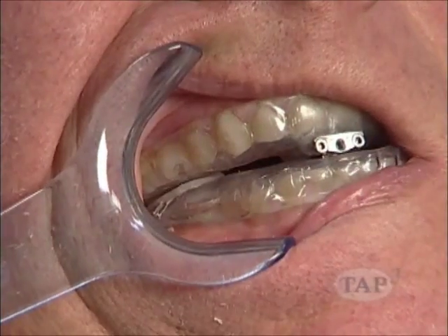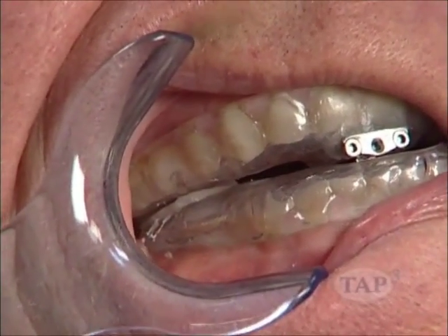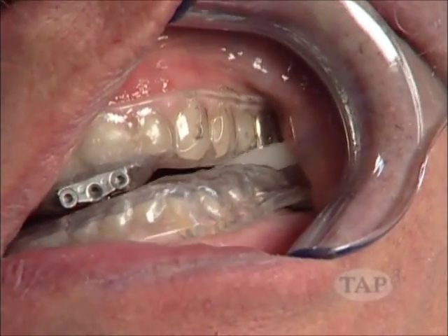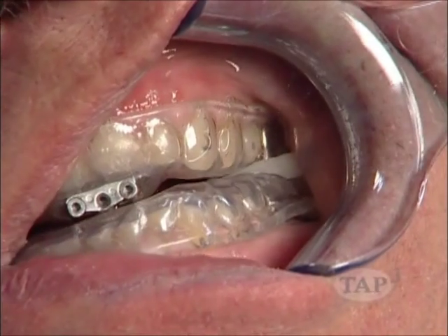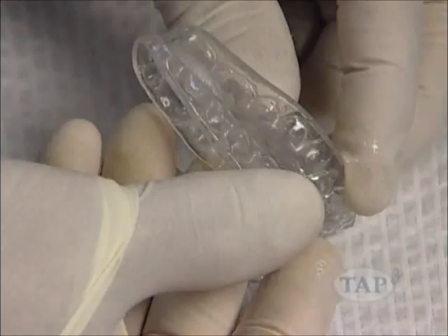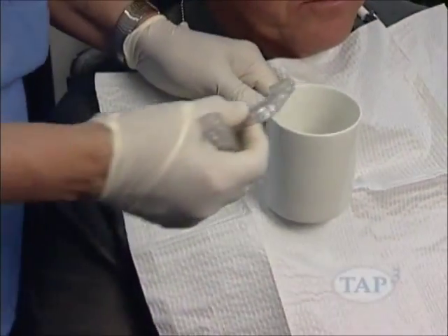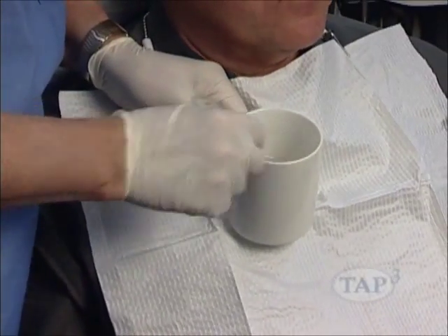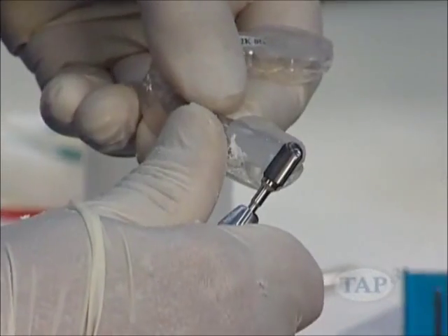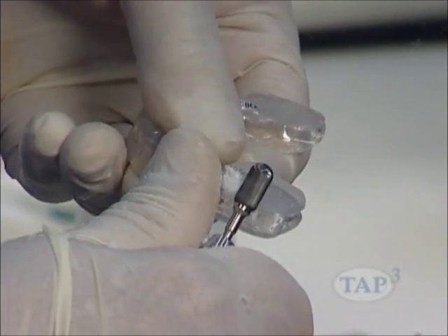Have the patient slide their jaw side to side. This will flatten the posterior stops into place. Have the patient remove the lower tray from their mouth. Place the lower tray in hot water to cure the acrylic stops. Trim, smooth, and polish the posterior stops once they fit properly.